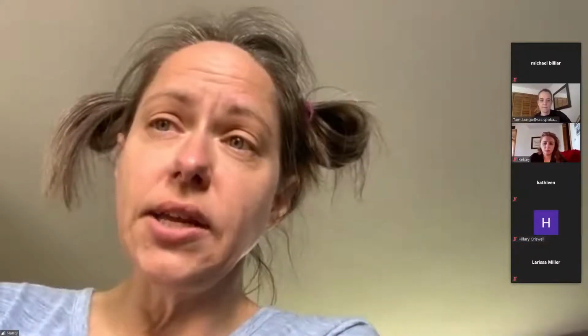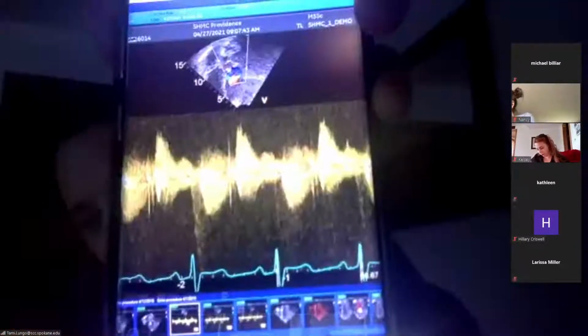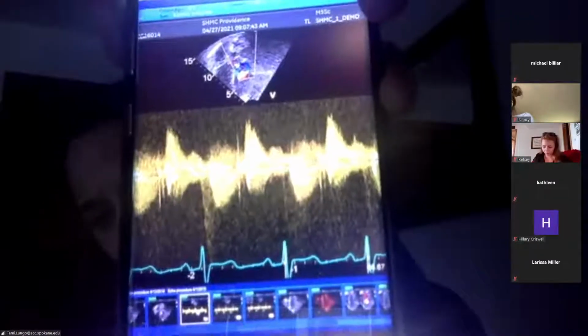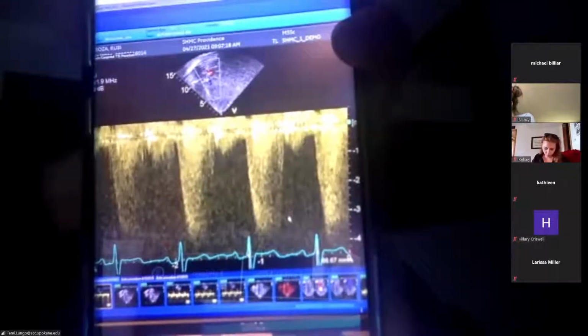Kemi, it did show right. It showed the way you showed me in lab today. Okay, Nancy, can you guys see that? Higher. There you go. So see all that stuff, that's the MR. I don't know if I can do another picture. This one's not going to show up as well, but you can also see them both right there as well. The LV outflow tract and the MR.